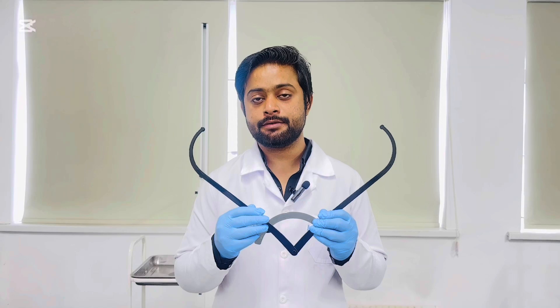External pelvimetry is a method of measurement of the dimensions of the bony pelvis using an instrument basically known as the pelvimeter.